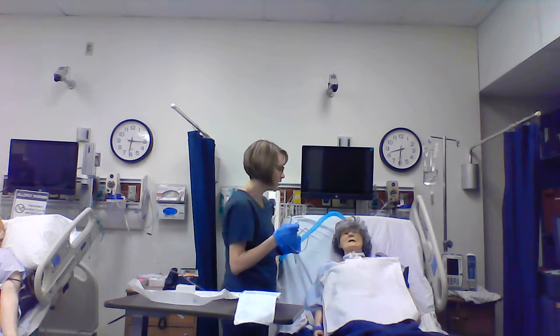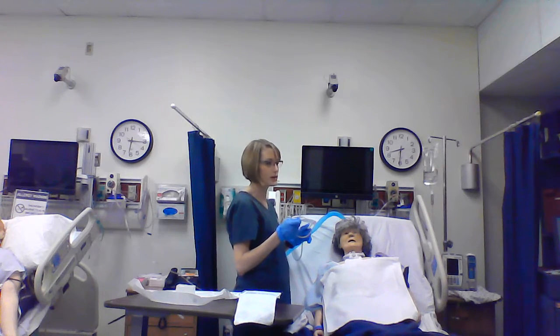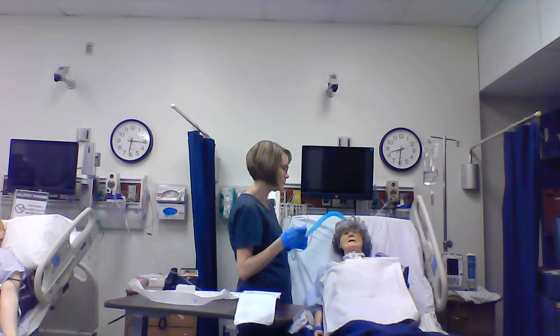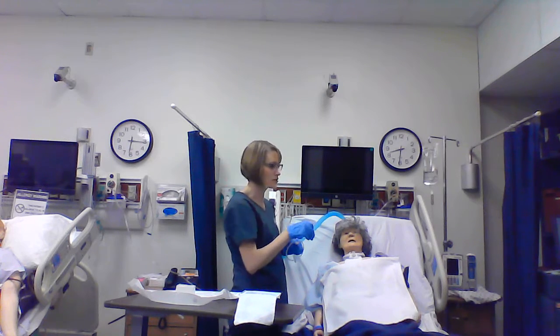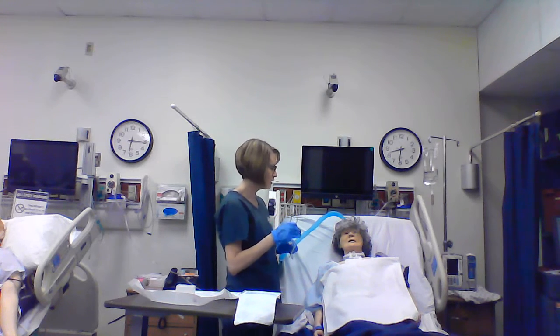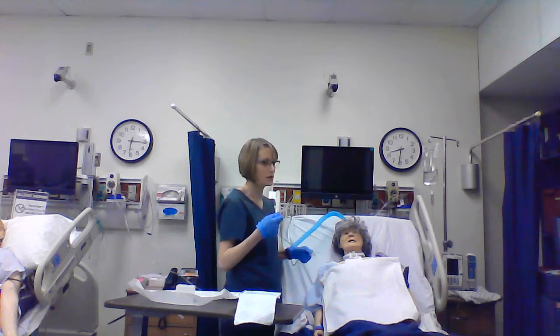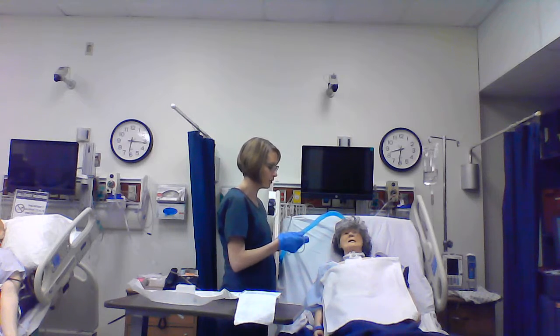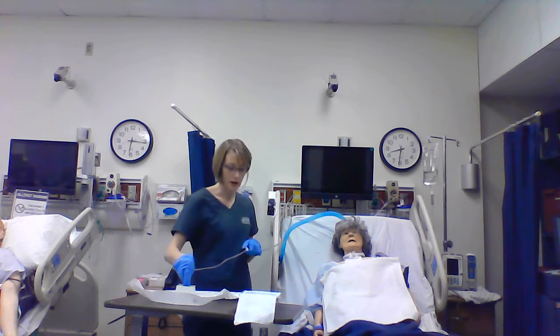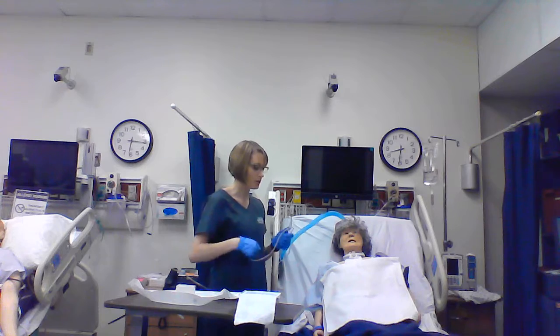And then if she needs to, you can reoxygenate her at this time, but you want to do that 3 to 5 times, or at least until the secretions are cleared and her breathing improves. And then of course oxygenate her in between if she needs to be reoxygenated, if her sats drop or she's in distress. So once you have suctioned her and you know that her secretions are clear, of course clean this out in between suction passes to make sure your catheter is clean.